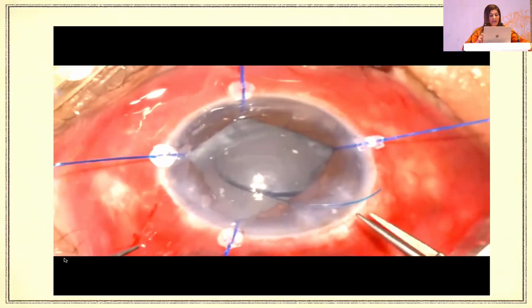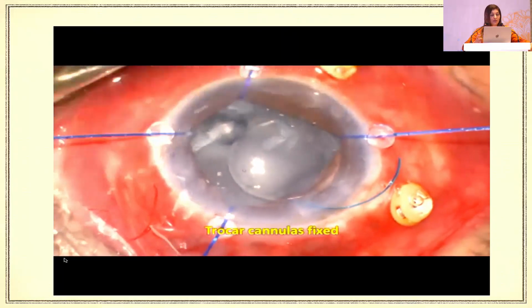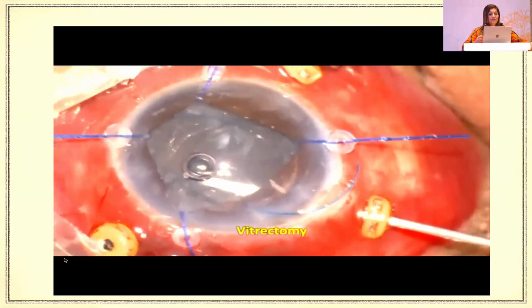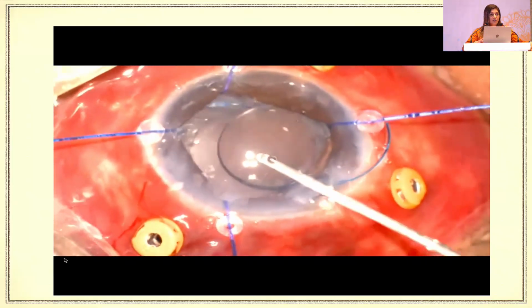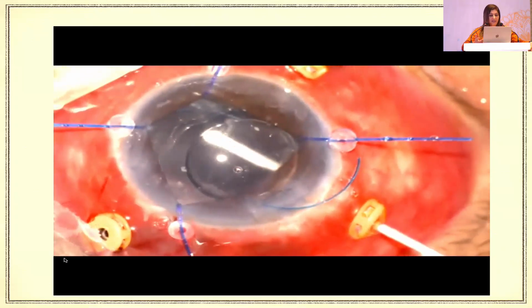Now, this is not what I would recommend, that okay, you are done with the nucleus, so you are done with the surgery. No, there are many other aspects to be taken care of in this particular case. You need to also remove the remnant nuclear material which is around this intraocular lens, and also something which has fallen behind into the vitreous cavity.